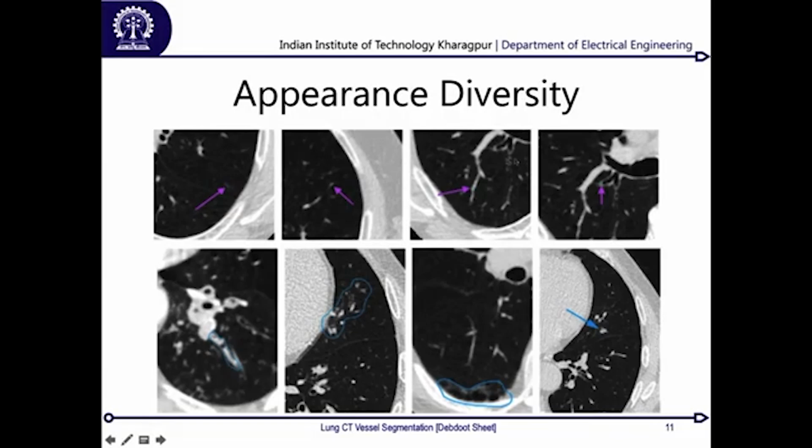Now in some high resolution versions you have these small ones very easily visible, but some of them are very low resolution, and often these bundles of vessels which you see here would get mistaken for some sort of mucinous deposit or another kind of abnormality. Or sometimes, like here, it's possibly not a vessel, but it has an appearance similar to that. So these are all the challenges you have when looking at a 2D space instead of the whole 3D space in the vessel segmentation problem.